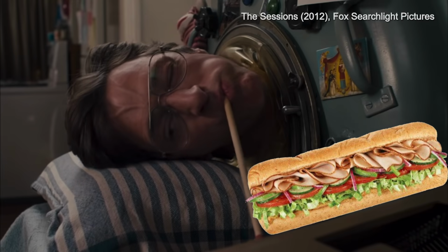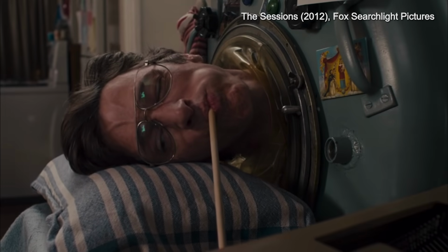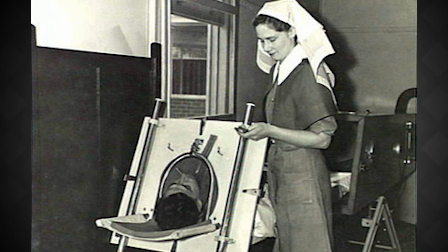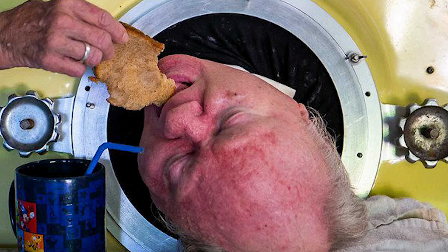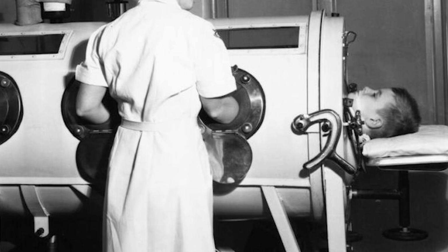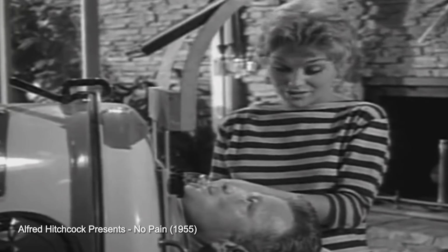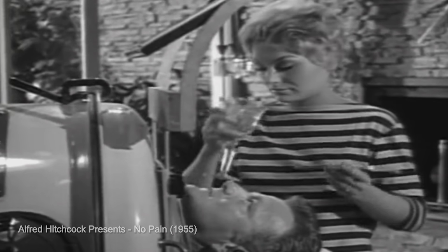A foot-long stick can't help you put a foot-long sub in your mouth, however, so lung living meant relying on others for basic everyday needs like eating food or changing clothes. Since the head is exposed, you can eat in a lung, but swallowing can be a bit tricky, as Marshall Barr pointed out. Since a person was flat on their back, they really needed to be careful when swallowing. Swallow in rhythm with the machine because it's pulling on the diaphragm and then pushing it out again. Patients had to wait until the iron lung breathed out to swallow.